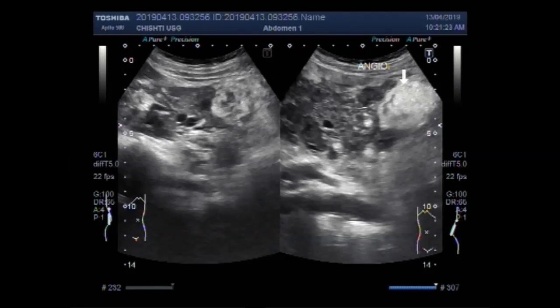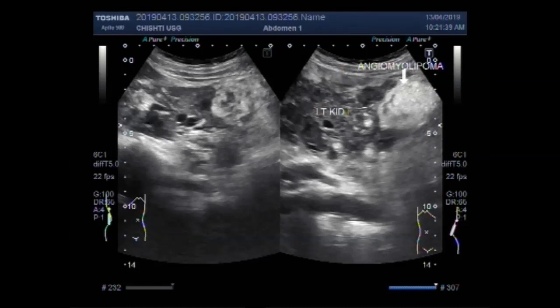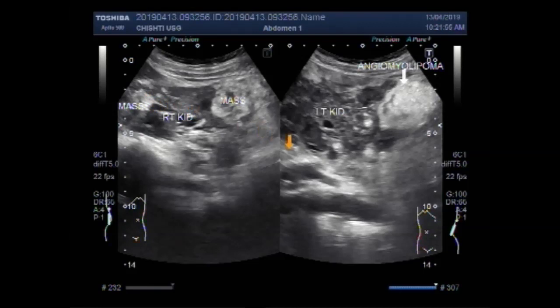Angiomyolipoma in the lower pole of the left kidney, and two similar masses — angiomyolipoma — in the right kidney.